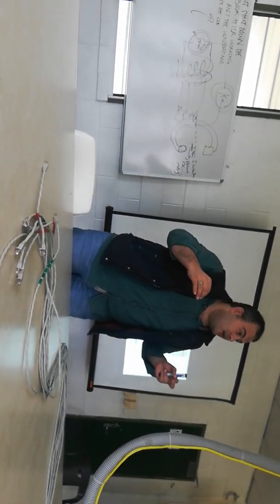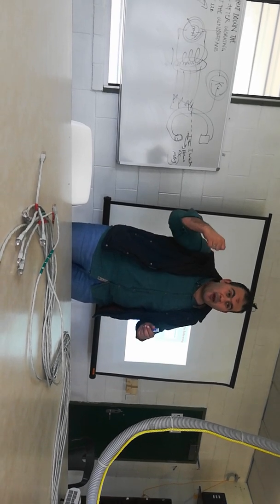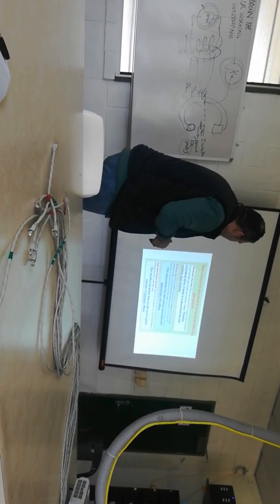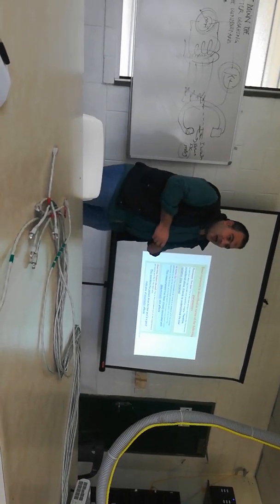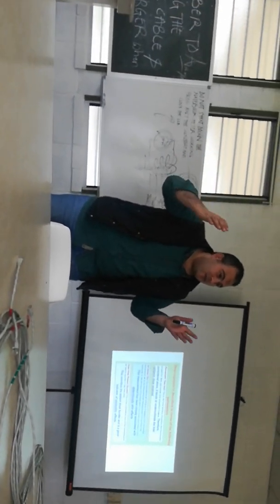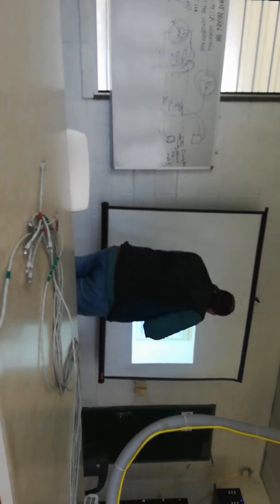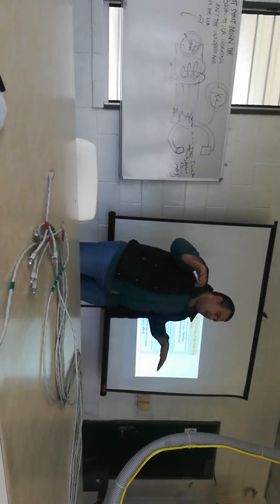Skin effect. This point measures the skin dose of the patient. But for the dose area product, this is the cumulative sum of instantaneous air Kerma and the X-ray field area. Accumulative dose, not only Kerma but accumulative, and multiplied by the area exposed of the patient. So this monitors the patient burden and is a good indicator for stochastic effect.